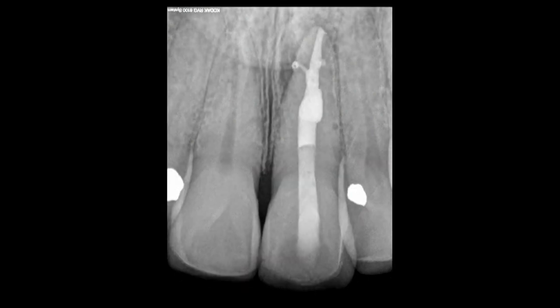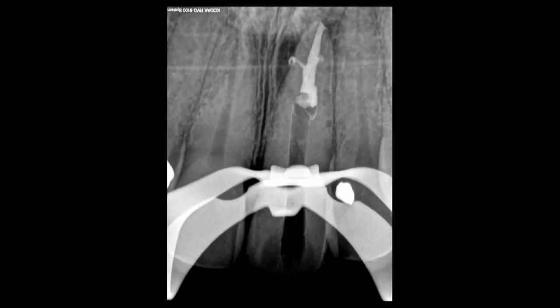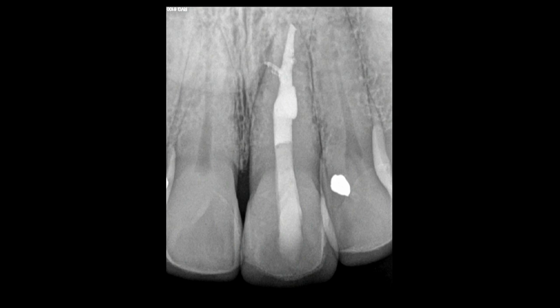A continuously tapering funnel, the walls are smooth, allowing the opportunity for material to flow wherever significant portals of exit exist. And notice the access cavity. It's appropriate, not too big, not too small. It has preserved the precious ferrule and yet has allowed us enough funnel form to create the hydraulics for a successful result. And we might even imagine further into the future and see it healed. So first of all, we have to make the shape. We make a cone fit. We have a down pack. We have a finish, and there it is healed, just the way we imagined it.